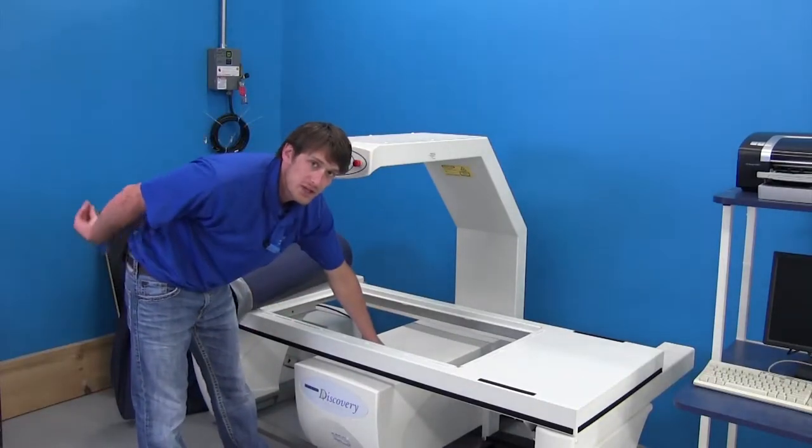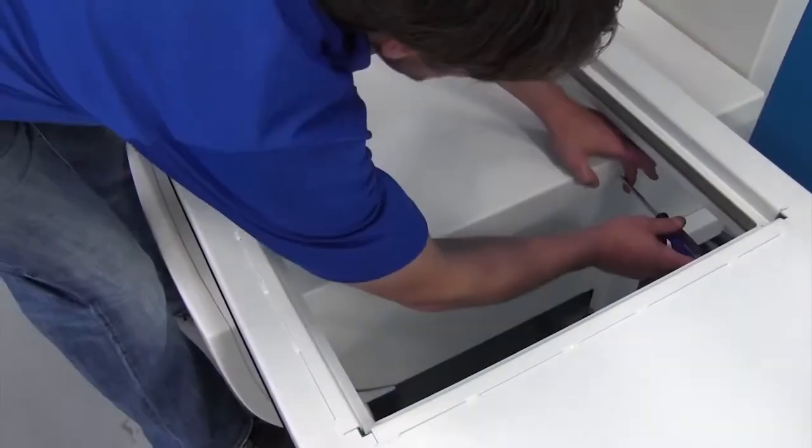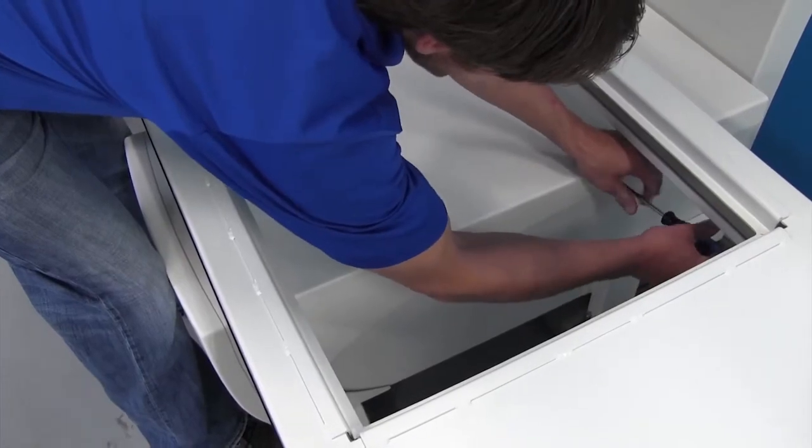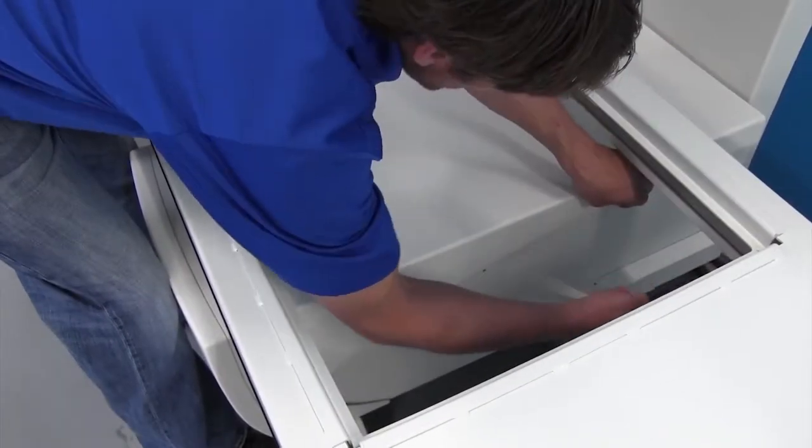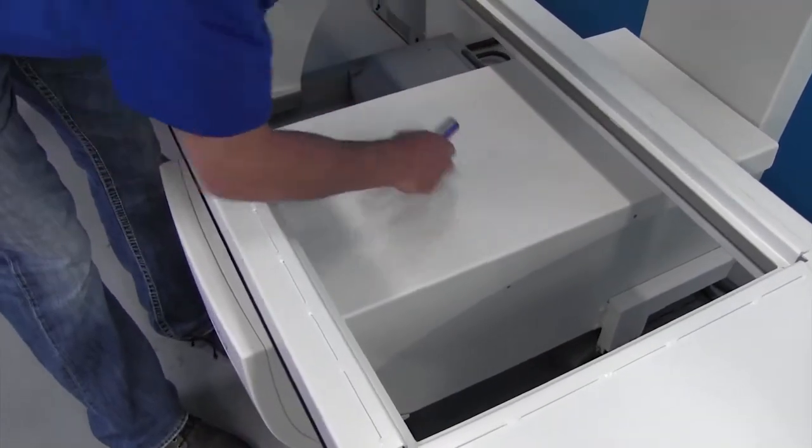First you have to remove the plastic cover on top. There are two screws on each side to remove those. Just a regular screwdriver is used to remove these screws. Very simply, again, one on each side. I've already removed the one on this side for you.